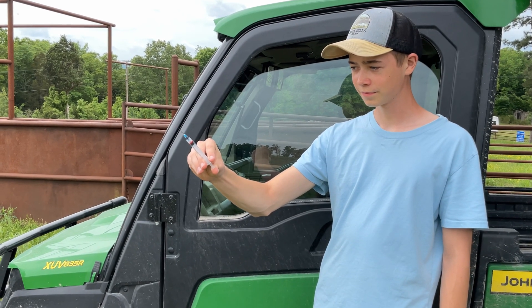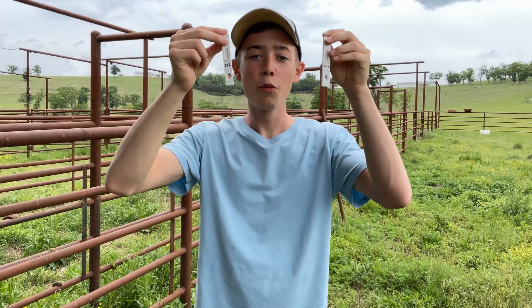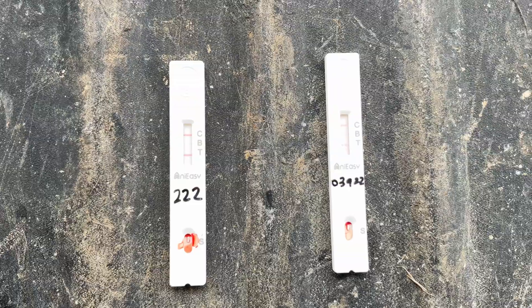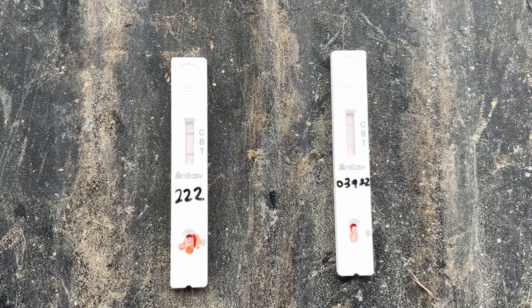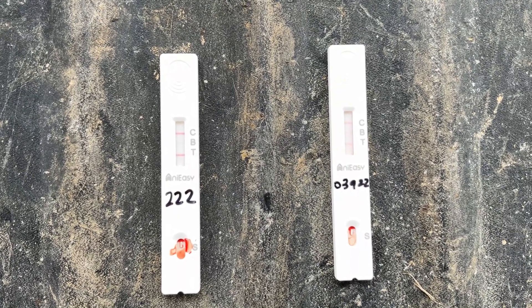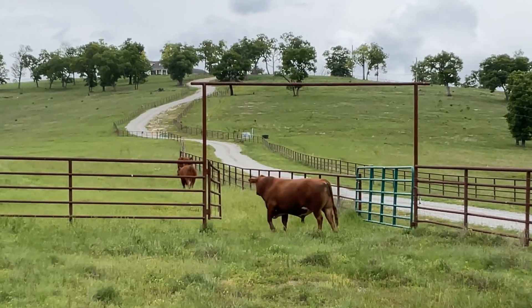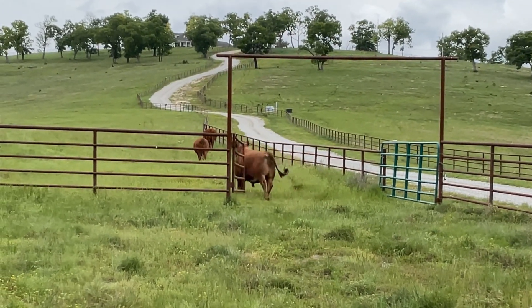After squirting some blood around for a little while, the results were in — we're pregnant! Both tests were positive. That's great news for the farm. We will be having two more South Pole calves. We then left the heifers back in the field with Patrick. To say he was happy is an understatement.